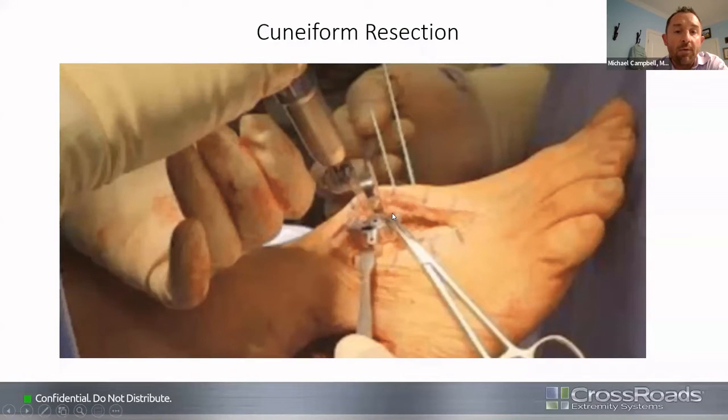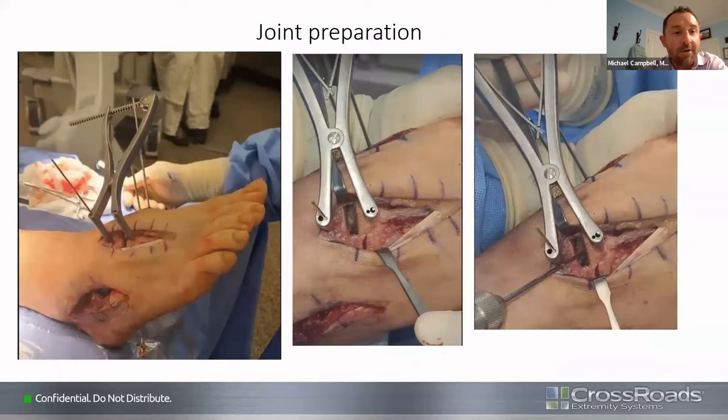I don't like putting more holes in the metatarsal than I have to, so I usually just grab a little hemostat and I grab the wire at the clamp. The other option is you can have your surgical assistant put their finger there if they trust you. My nurse practitioner apparently doesn't trust me, so we use the Hinterman. After the joint preparation, after you use the guide and you put the Hinterman on, this is the view that you get. And I think this is just absolutely beautiful.